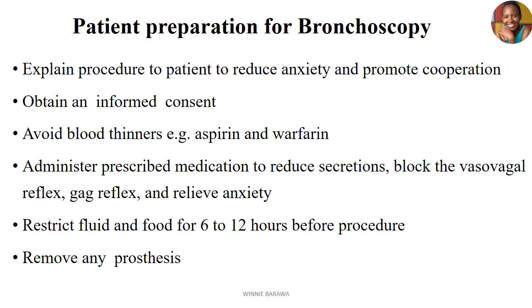So these are medications to just help us have a very calm environment as we are going in to check these airways. Then restrict fluids and food for at least 6 to 12 hours before the procedure. This is basically where we say maintain nil per oral for at least 6 to 12 hours before this procedure. Why? Because this is to reduce the amount of peristalsis in the gastrointestinal channel, and the purpose is to avoid regurgitation of this food while we are exploring the respiratory system.